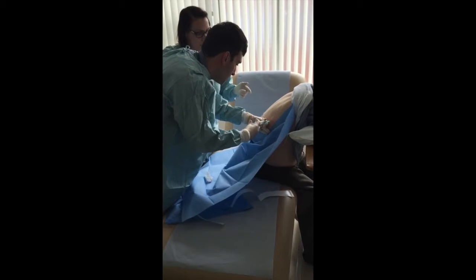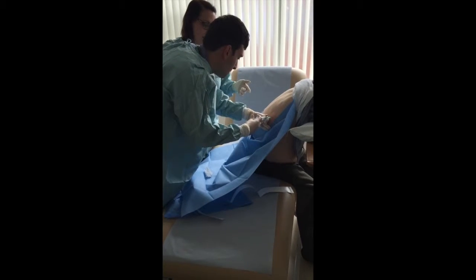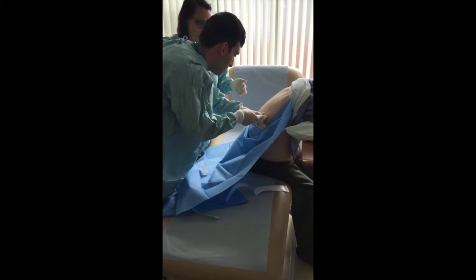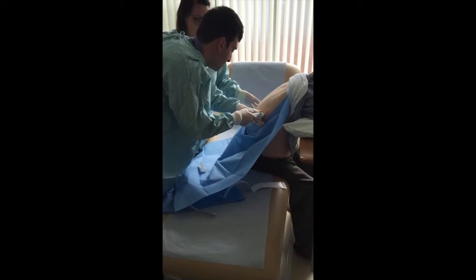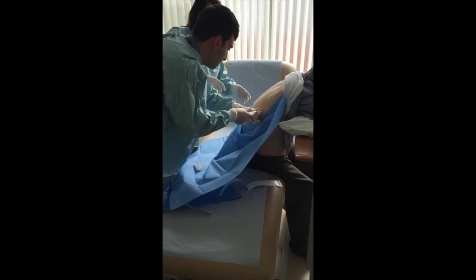And just give a squirt. If you touch the periosteum of the bone, it's quite painful, so just give a good squirt of lidocaine there. Further in. If you feel like you're touching bone or anything like that, you should just be able to go through it. Not straight yet. Just aspirate and infiltrate. A little bit deeper. You're starting to get pleural fluid there.